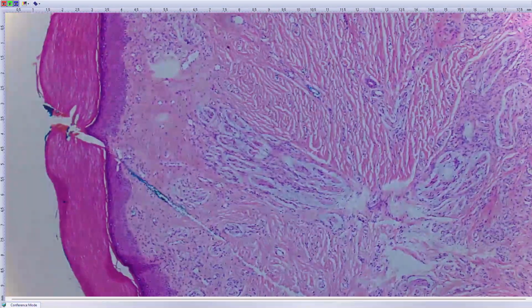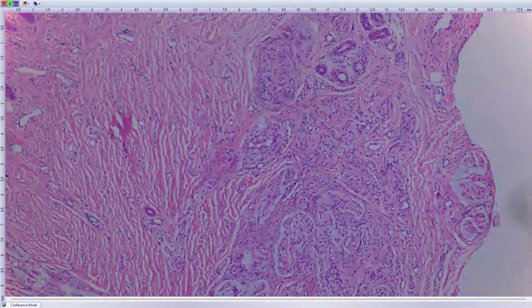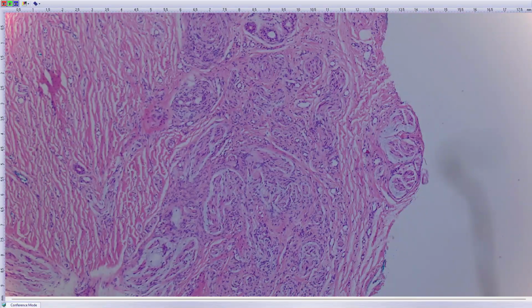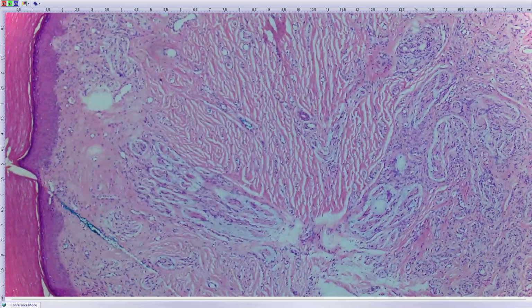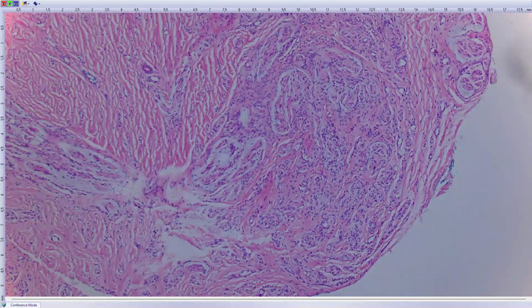So this is just a curiosity, a rare thing, and not to be diagnosed as amputation neuroma, because the child has no history of operation. You will have amputation neuroma in a few years after this surgery.